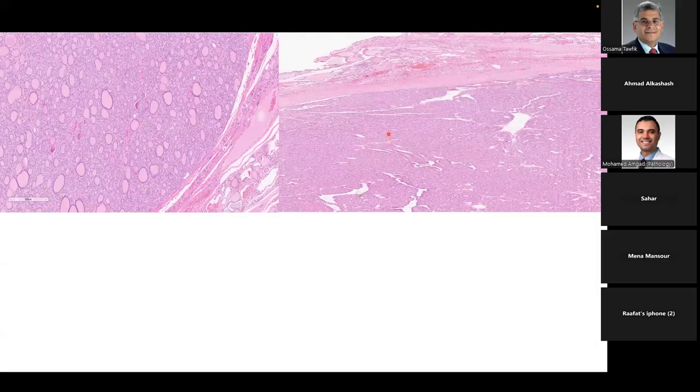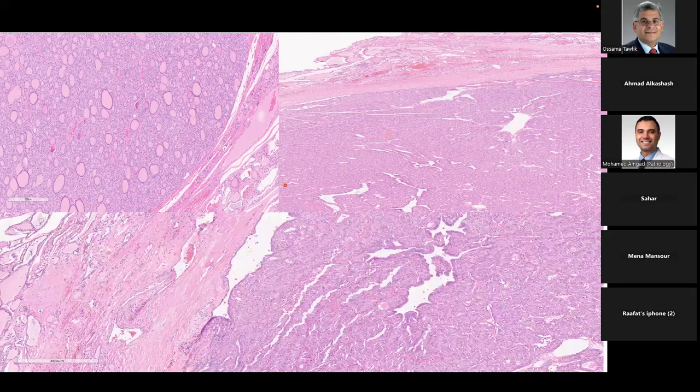And of course, what you need to look for as well is, in the thick capsules, you'll start getting these well-formed vascular structures right here with thick vascular walls, and you could see here the endothelial cells lining these. And this is where we look for angioinvasion. Okay, not inside the tumor. You're looking at angioinvasion within the capsule of the thyroid lesion. Okay.